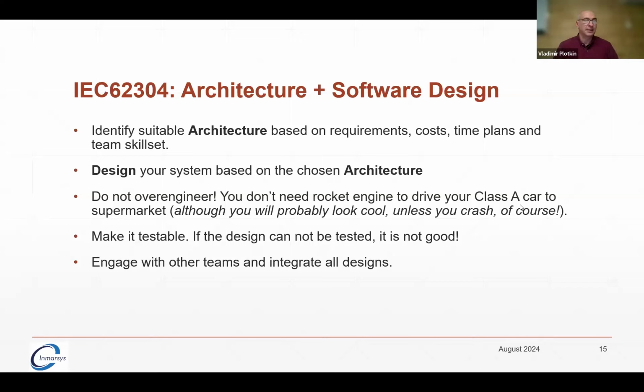Then you're analyzing the potential costs. I know software guys normally are not looking into costs, but they need to be aligned. Otherwise they will put the most powerful microcontroller they can find on the market, whereas in reality they only need something really cheap with small memory, like an MSP430, which only costs a couple of cents, rather than something which costs $10.